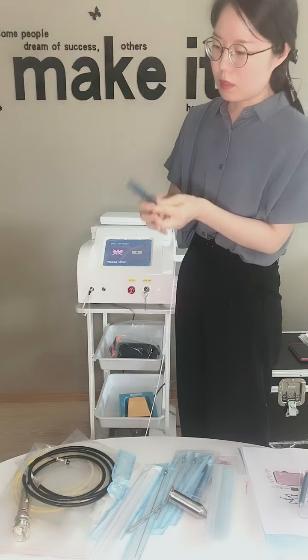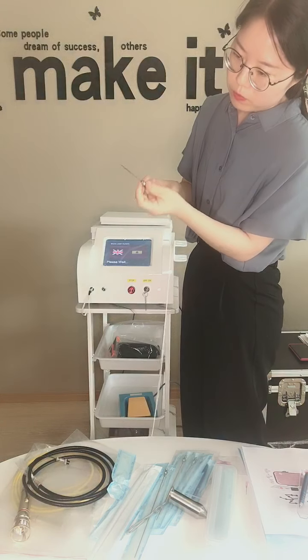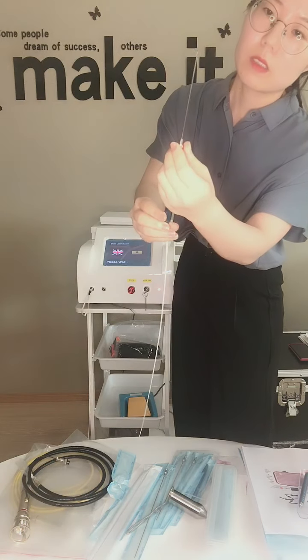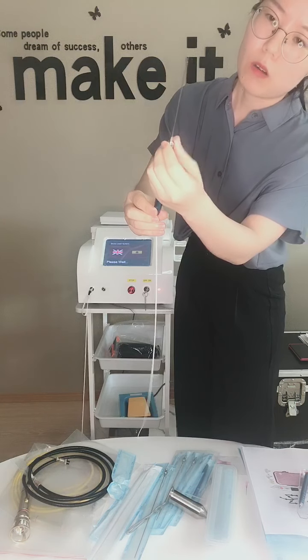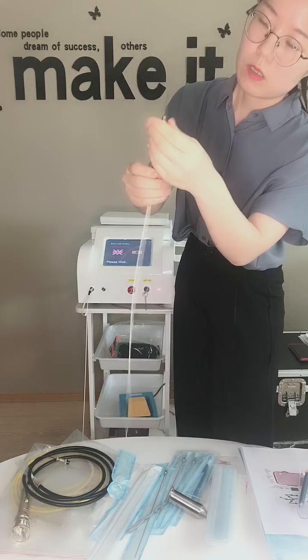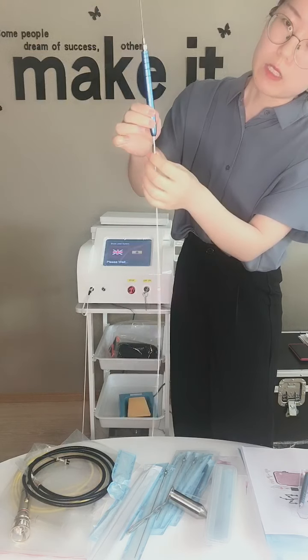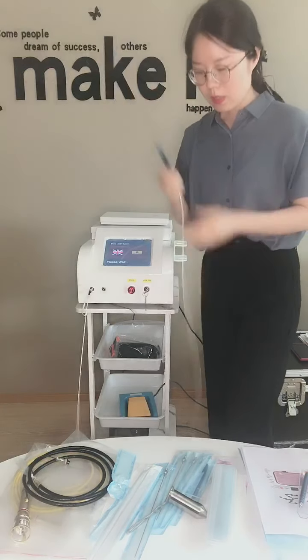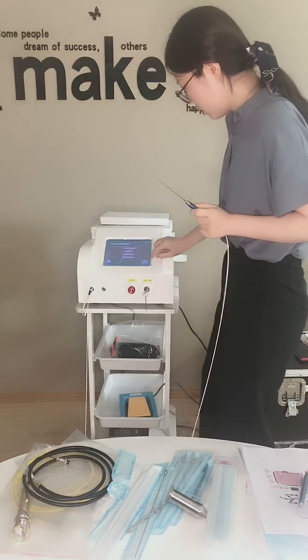As I just said, the needle is used to fix the fiber inside, so when you first put it on, you can just wait until you can see the fiber. See here? You need to pull the fiber out 2 centimeters or 3 centimeters, and then next you make it tight. Oops, sorry, make it tight. And the fiber inside is fixed, and you can't get it out. It's very convenient. And next, I will show you how the laser fiber works on the handpiece.